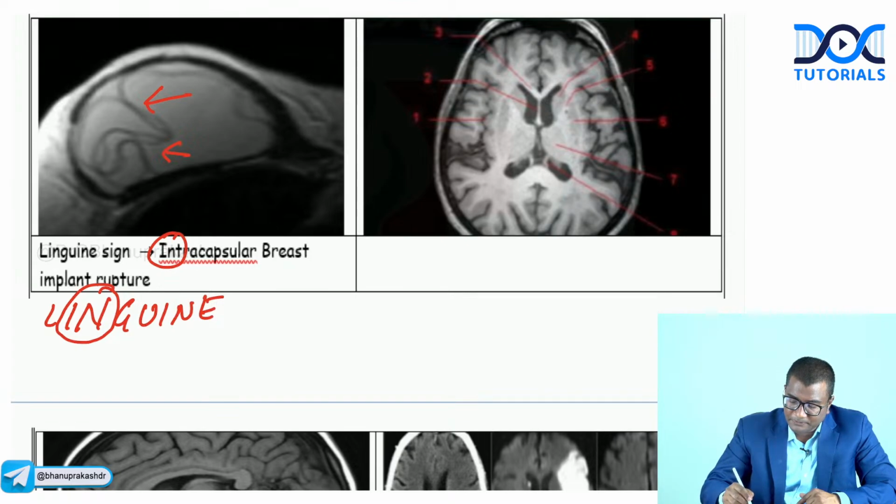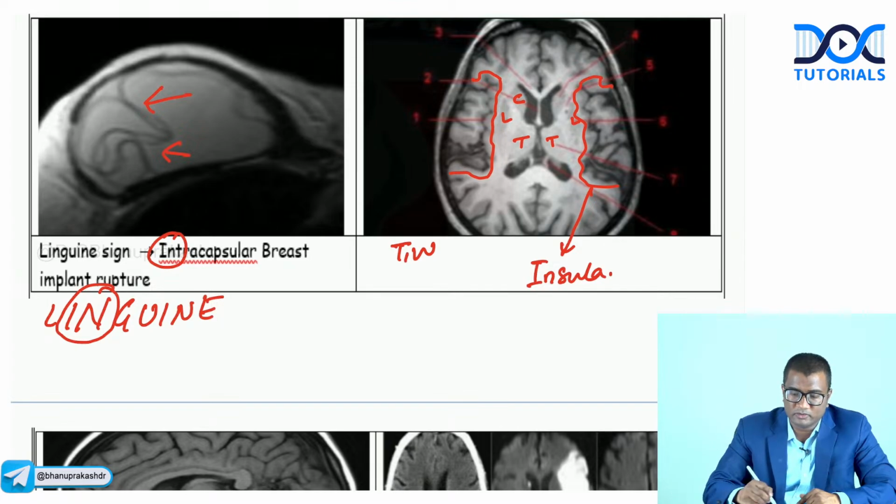And you can see here, this is a T1 weighted image, which is showing the anatomy nicely. You can see the basal ganglia structures, the caudate nucleus, the thalamus on either side of the third ventricle, the lentiform nucleus. Can I ask you, what is this gray matter surrounding the sylvian fissure? This is your insular cortex. So these are important.